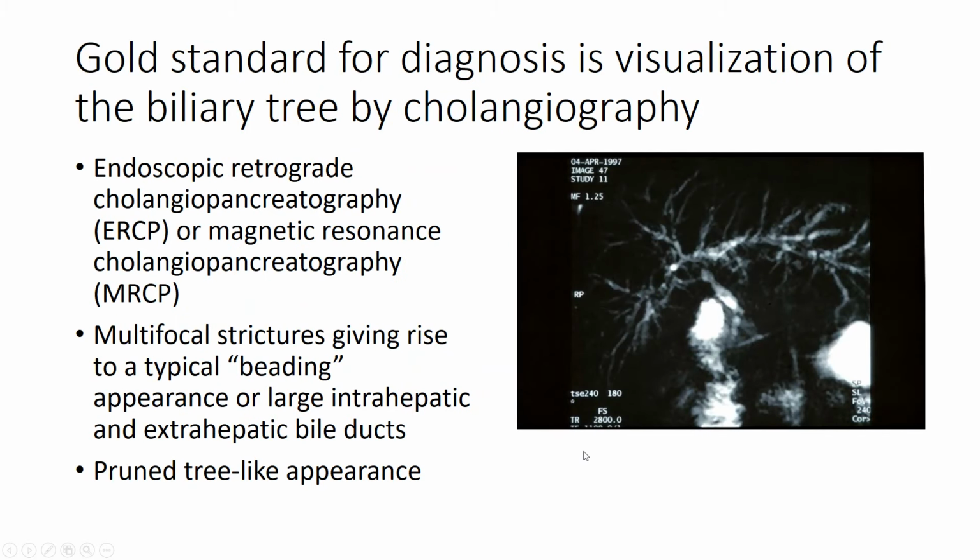The gold standard for diagnosis is cholangiography, either ERCP or MRCP, although ERCP is more diagnostic. This is an MRCP from an old case, showing the beading appearance of the biliary tree. It's described not only as beading, but also as a pruned tree-like appearance.